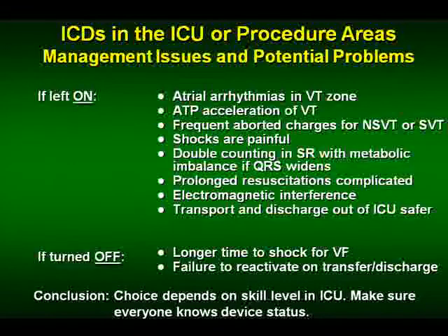Electromagnetic interference is important. And the big thing is, however, that you don't have to worry about somebody getting transferred out of your unit in the middle of the night, put on a floor bed, and dying without his defibrillator on. So most units at least modify their programming but leave the defibrillator on. If you turn it off, it may take you longer to shock for VF, and you do have to worry. The worst thing you can do is actively turn it off, and then send somebody for a scan or an angio or something, and they die on the way there because you thought their defibrillator was on.